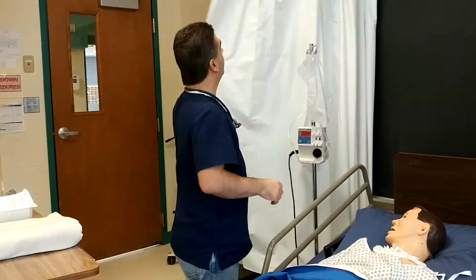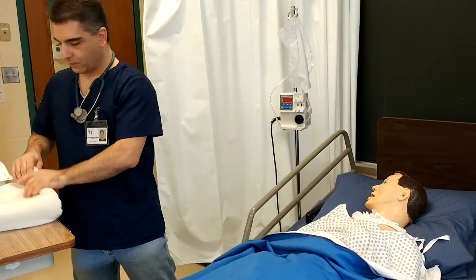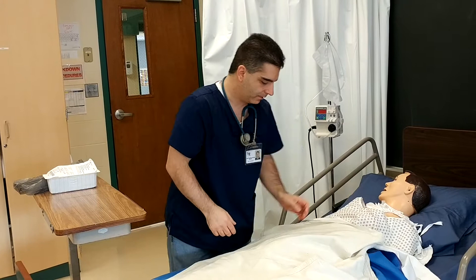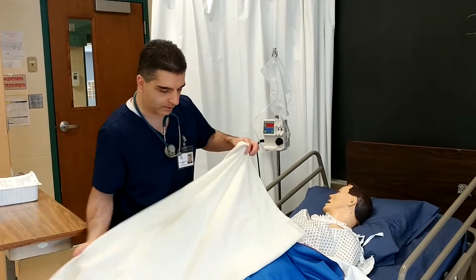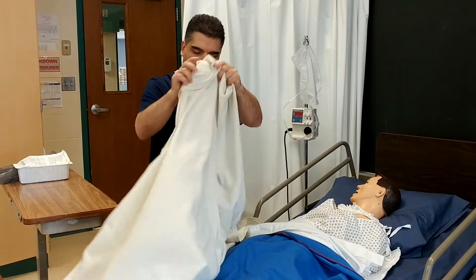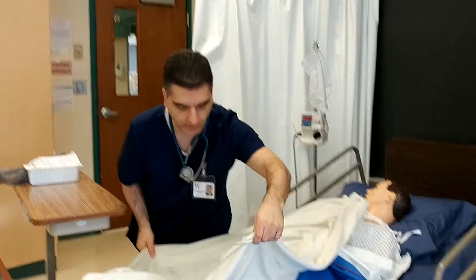I just washed my hands. I'm going to move the proxy. I'm going to raise your bed up a little bit. And I'm going to drape the towel over you. Before I start, are you allergic to any iodine, or anything like that? So you're not? That's good. Now what I'm going to do is put this into a diamond-shaped position with the blankets — one point down here, one point up here, and one point over here. Kind of like a cross.